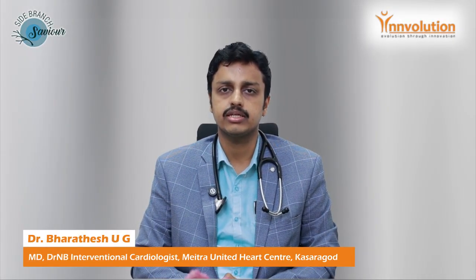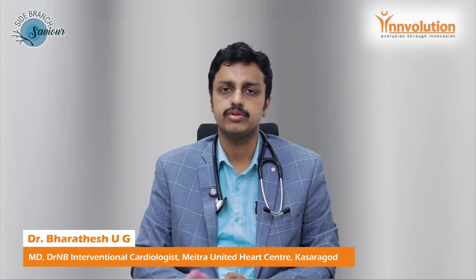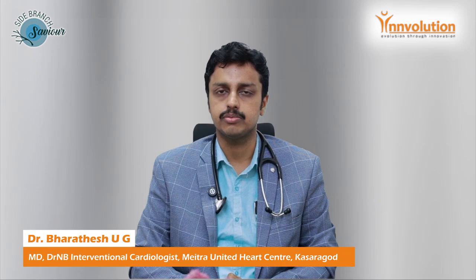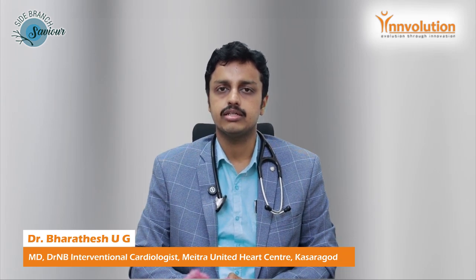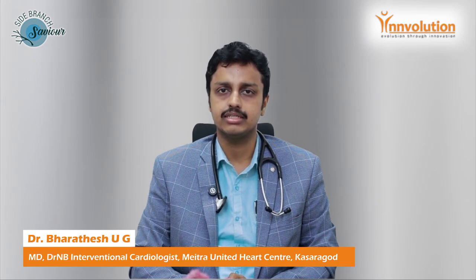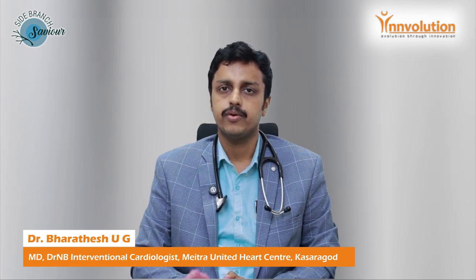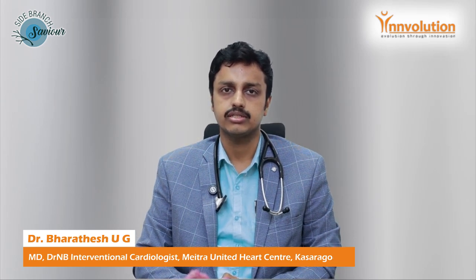Out of these cases, I usually see 10 to 20% are very complex, which have calcium, which are tortuous, and ostial lesions, which involve the left main, LAD and LCX. For this, we require a very good cath lab team with supportive staff. Along with that, the hardware should be very good, with international recognition and the open cell design, as I told earlier. Very good expansion capacity, which is seen especially in open cell design technology, so as to protect the side branch.